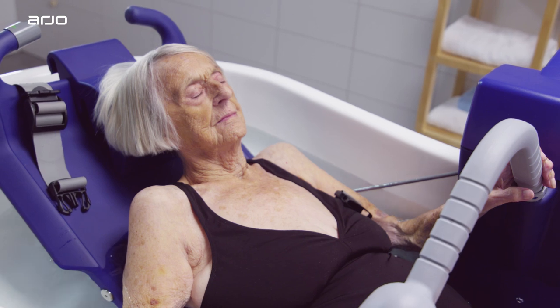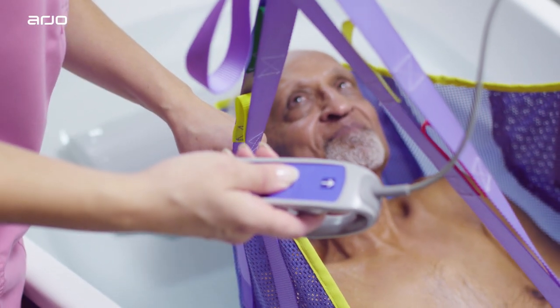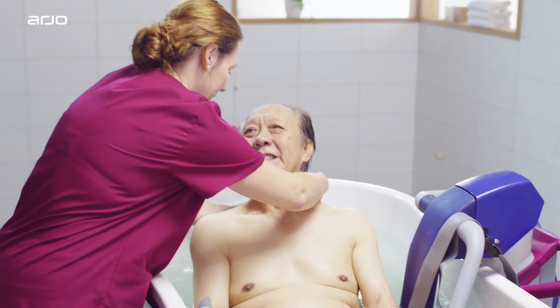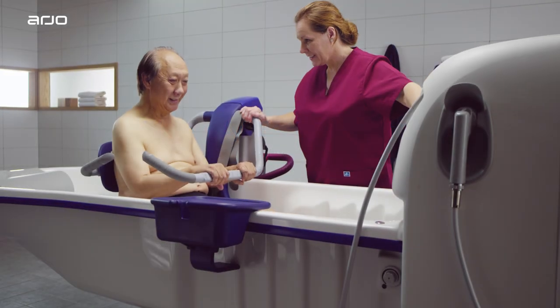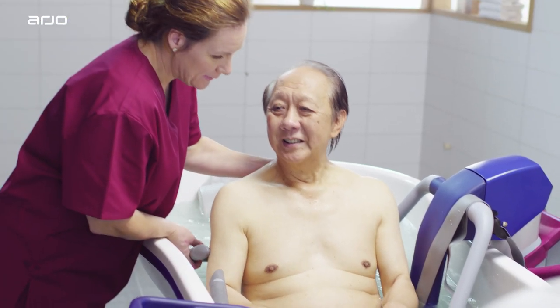Residents of all mobility levels can use the Rhapsody Bathing System. However, a resident's mobility level will determine the type of lift most appropriate, such as a trolley, ceiling lifter, or chair. This film offers guidance on transferring a wheelchair-bound resident to and from a Rhapsody tub, using an Alenti Hygiene Chair Lift.